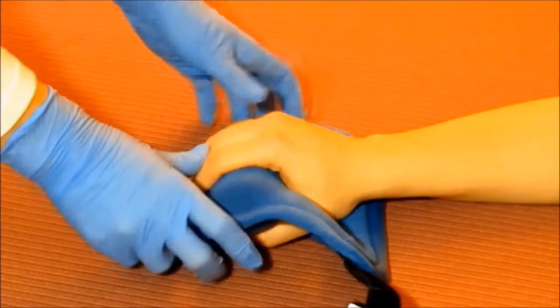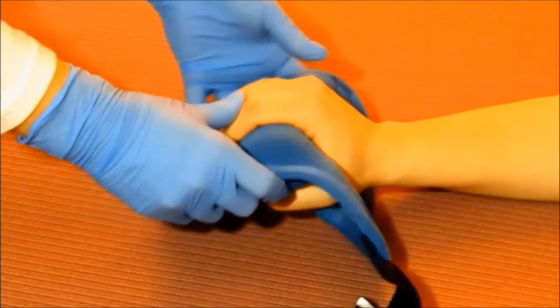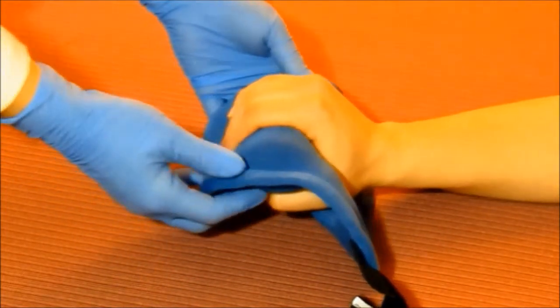Be sure the fingers are resting within the borders of the product and the cylinder roll is resting in the palm of the hand.